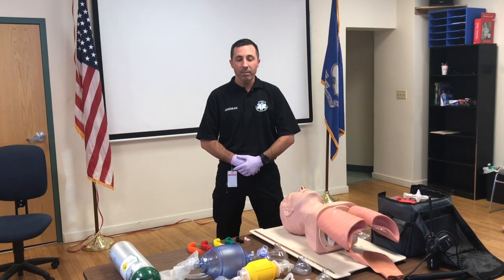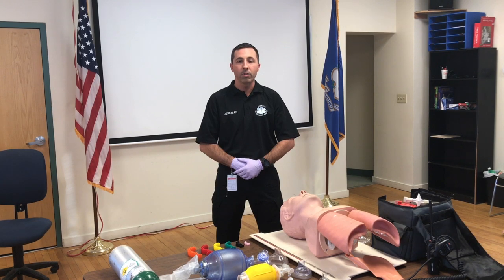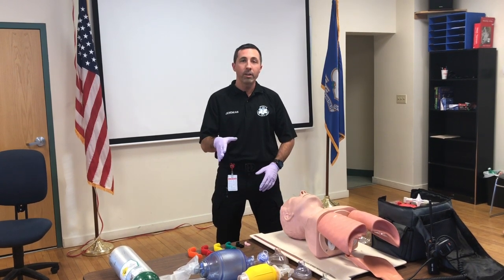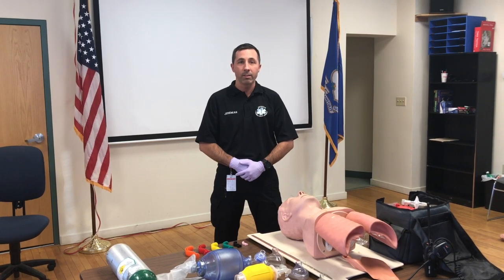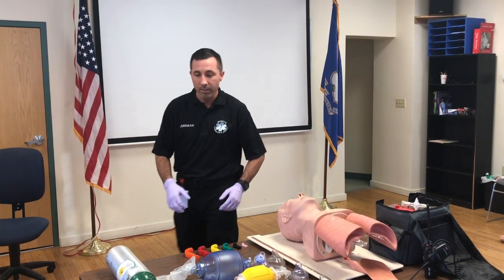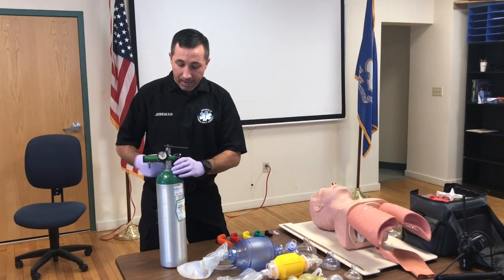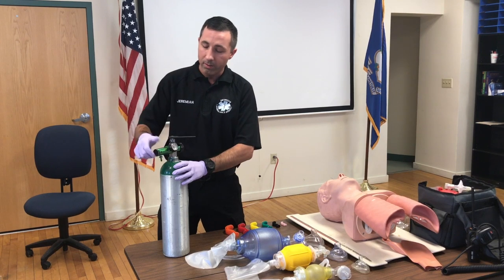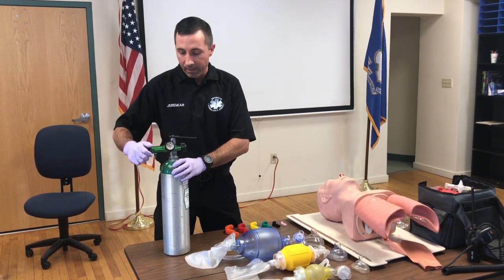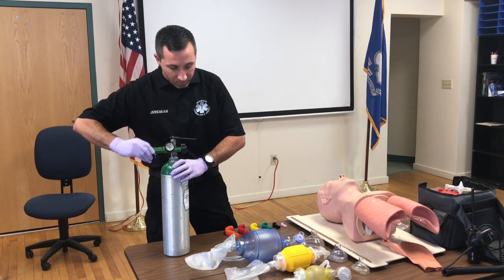Before we start this skill, you're going to be given 2 minutes to look over your equipment. I highly recommend that you do that. You want to make sure that you're familiar with the equipment that you're about to use, especially if you're testing at a facility that's not your training center. So in this instance, look at the O2 tank, look at the knobs. This has a big bulky knob. You want to make sure you're familiar with what turns the regulator on exactly, right? This is the flow meter selector here.